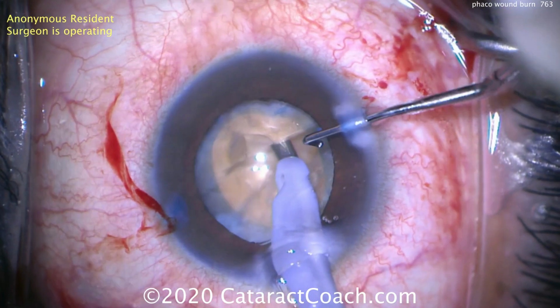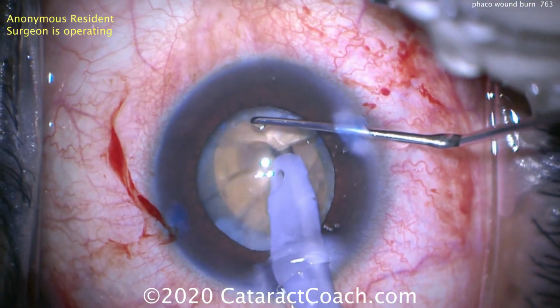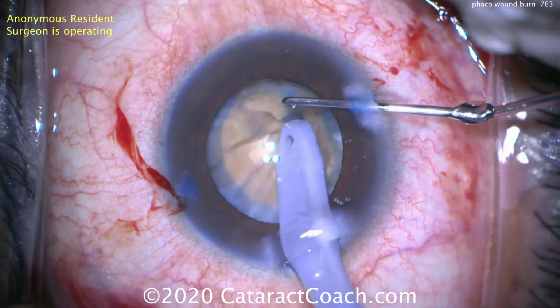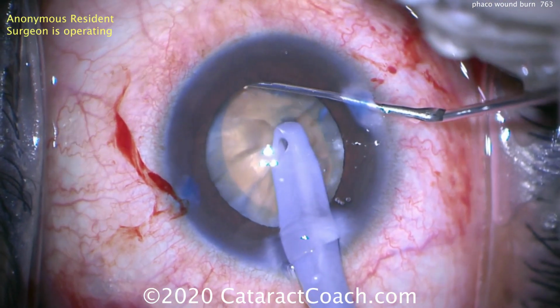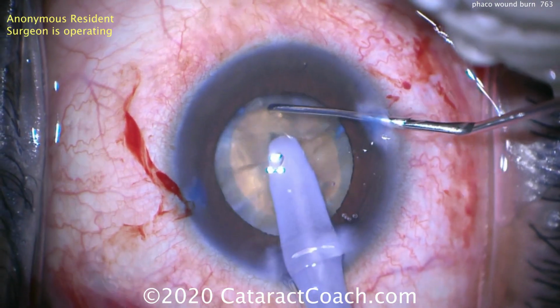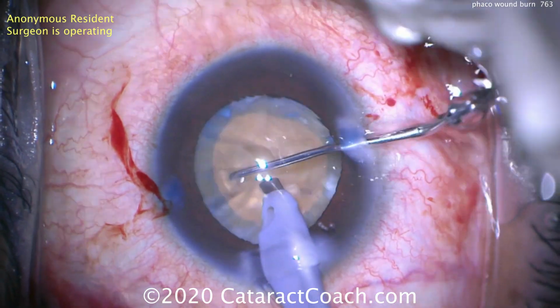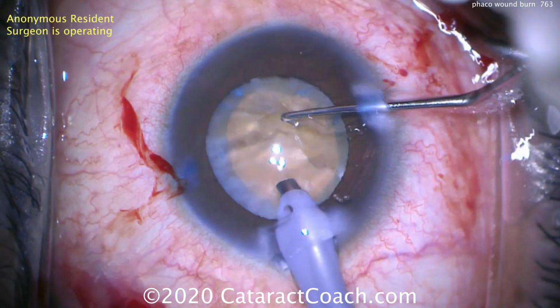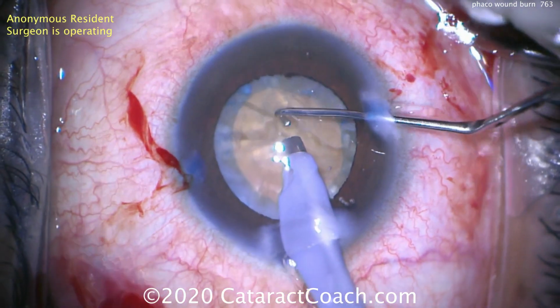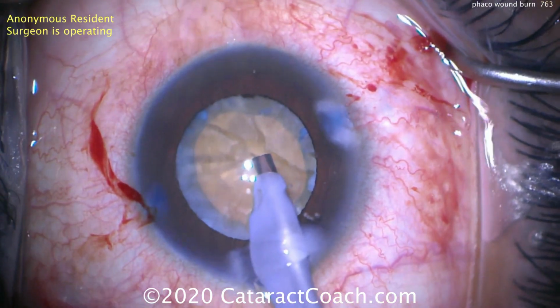Even now, still the phaco tip, the phaco needle is riding and rubbing against that cornea. Why? And the answer is the hand position. This is a resident who's not comfortable placing the hands in an appropriate position. Your goal in the surgery is not to place your hands where you feel most comfortable. No, it's to benefit the patient. Let the patient have 10 minutes of benefit here.